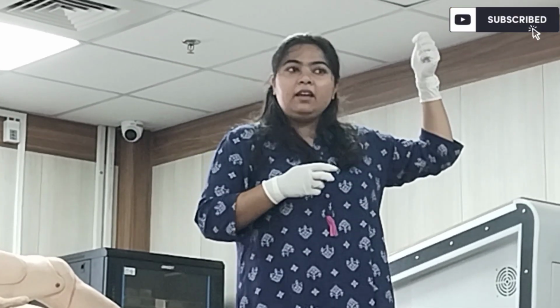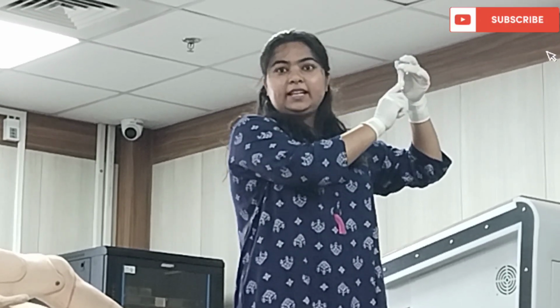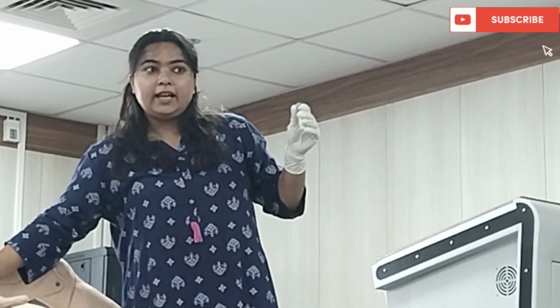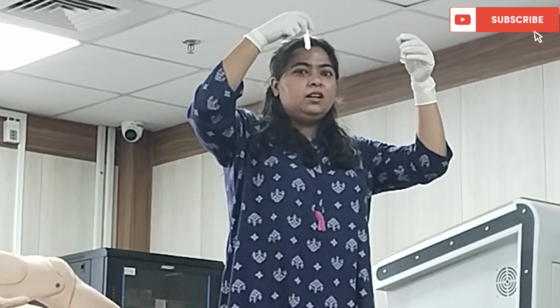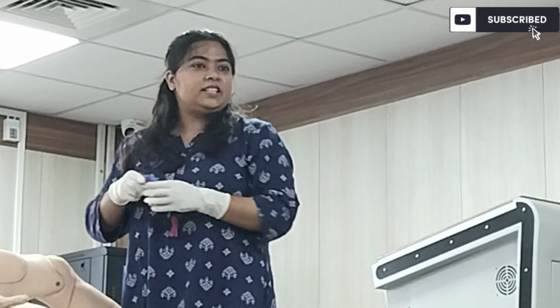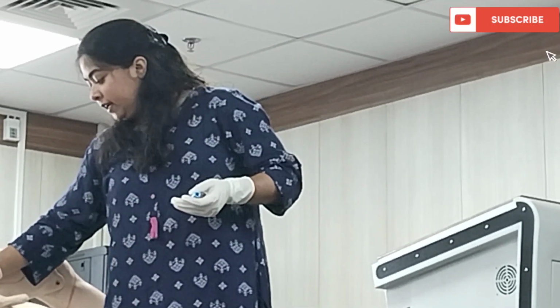So be very cautious while filling up the EDTA vial and the citrate vial that you fill up to the mark. If you are giving more blood, it is not in proportion with the reagent given, so the result will come out faulty.